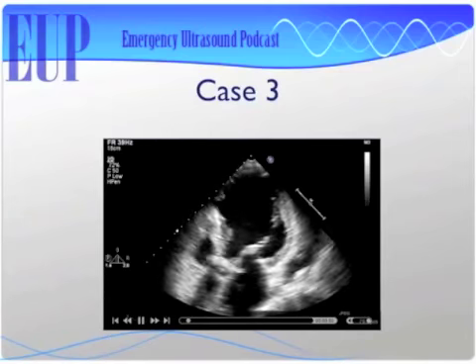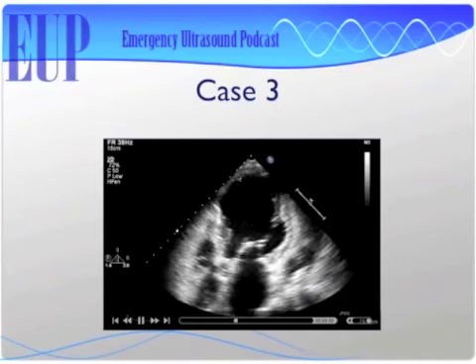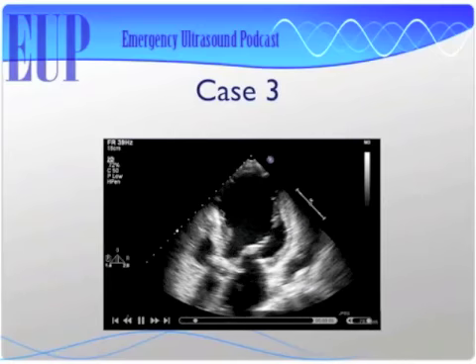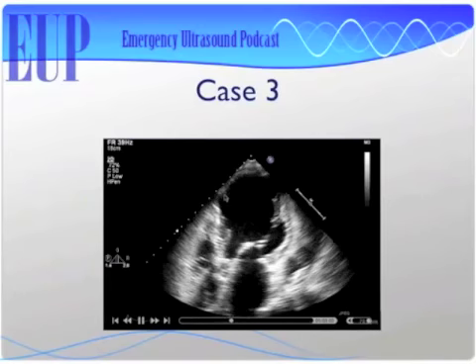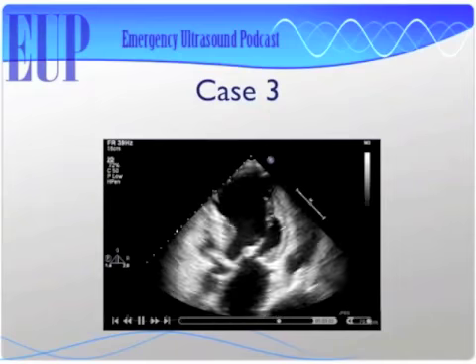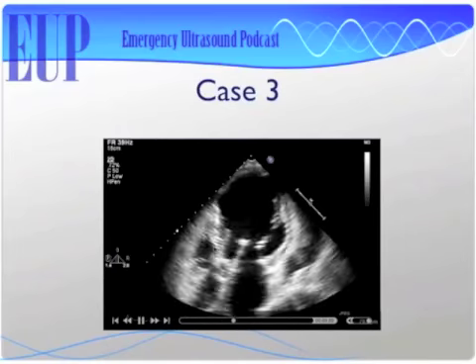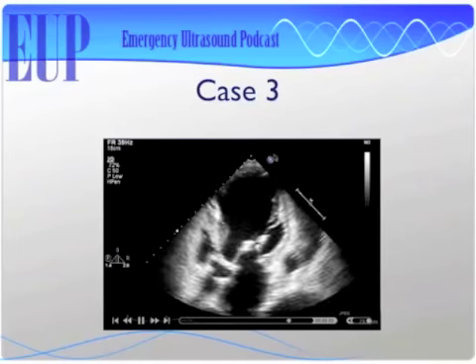But as you get to distal septum and to apex, you're not getting blood flow anymore. So this is sort of like a midway LAD lesion. It's not quite distal because you're still getting some of the septum out here, but it's definitely not a proximal LAD lesion. So that's why you're getting some function in the septum here, but nothing to the apex.